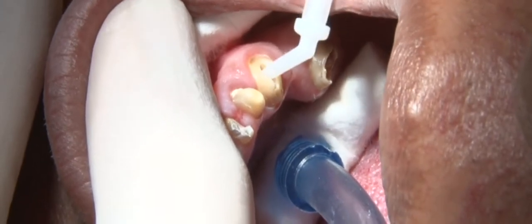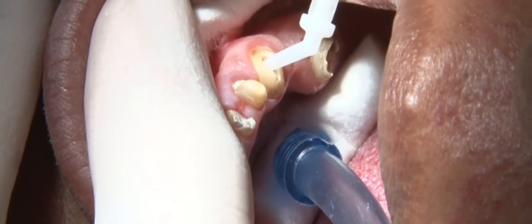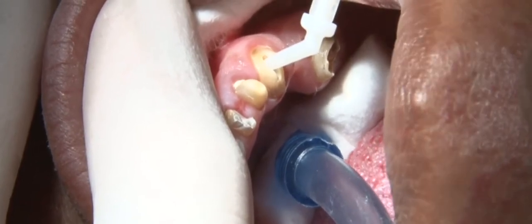It does not slump. When injecting it into the tooth, I place the plunger of the syringe into the palm of my hand and do not use my thumb to depress it. This gives me greater control. The post space is filled with Luxa Core Dual and the post is placed.